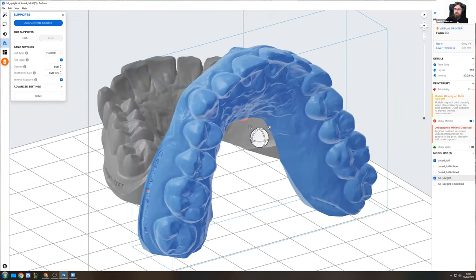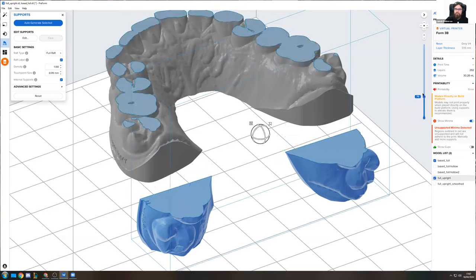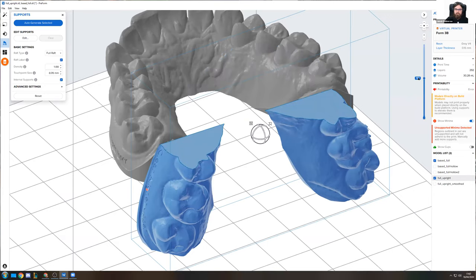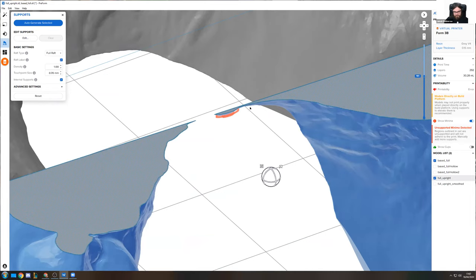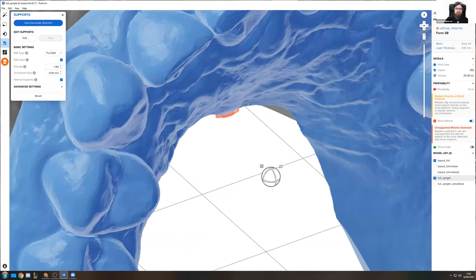But basically, while we're going through this printing process, you can also look at it by using the slider on the right side. We can see that a little bit later on, we'll have this little piece right here, which is just hanging in midair, and we can't have any parts of our model just hang in midair. So this is something that we will need to take care of.